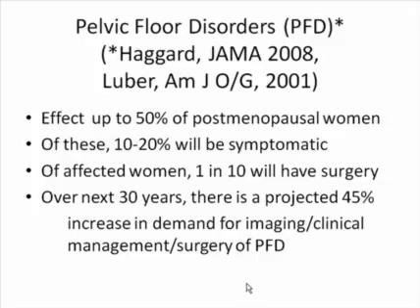I won't be discussing the role of ultrasound for seeing the urethra post the injection of bulking agents, but this is another application. As an overview, pelvic floor disorders affect up to 50% of postmenopausal women, and of these, 10 to 20% will be symptomatic. Of the affected women, 1 in 10 will be projected to have some type of surgical procedure over the next 30 years. It's a projected major increase in the demand for imaging and clinical management of women with pelvic floor disease.